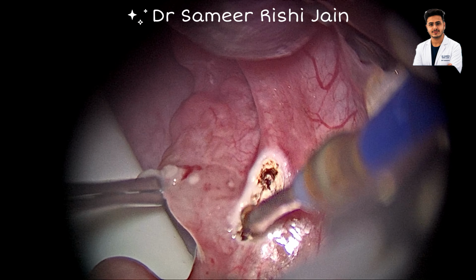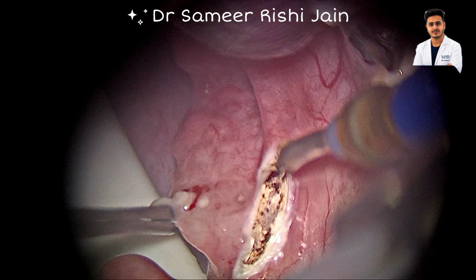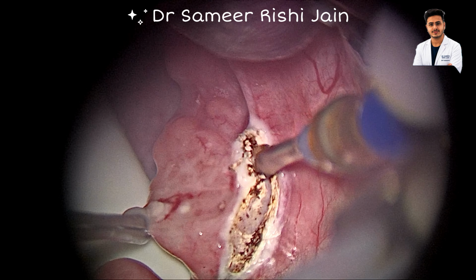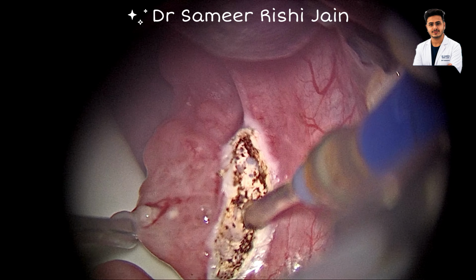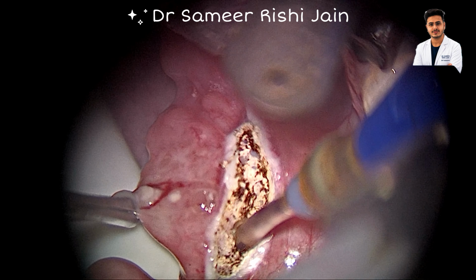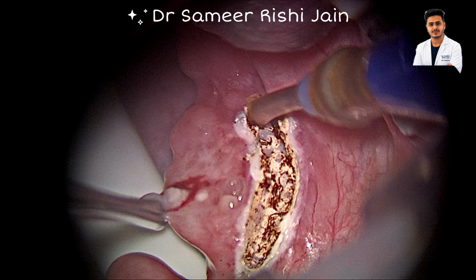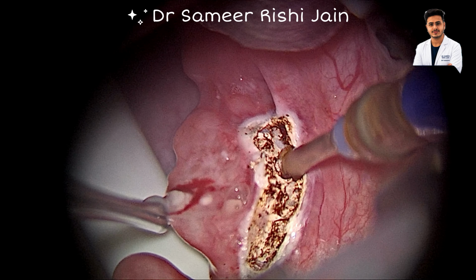I am incising the mucosa at the level of the anterior pillar with the help of cautery. I am trying to find the correct plane of dissection. As the tonsils are a little bit endophytic, I am having difficulty finding the plane.